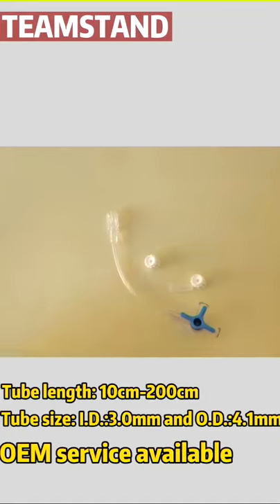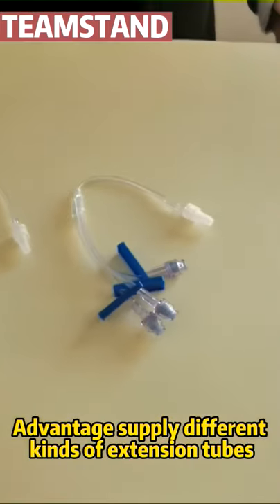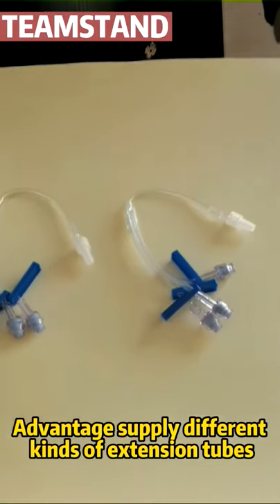The length of extension tube can be customized. We can provide different kinds of extension tube. If you want to learn more details, just visit our website.